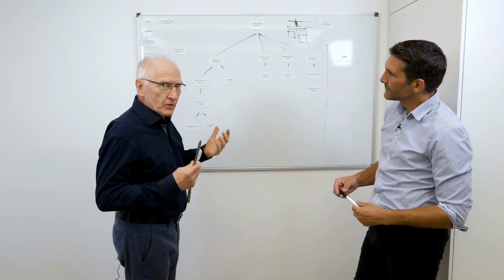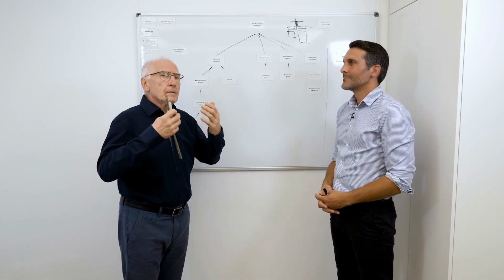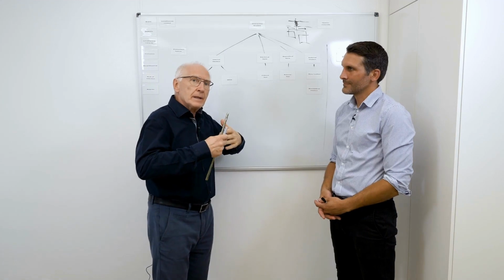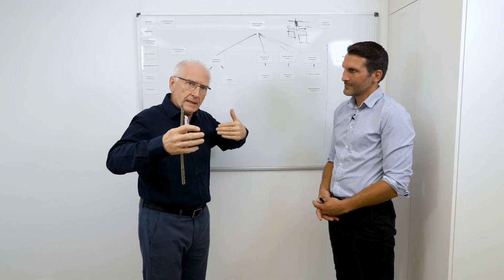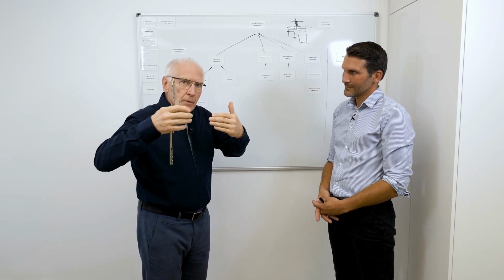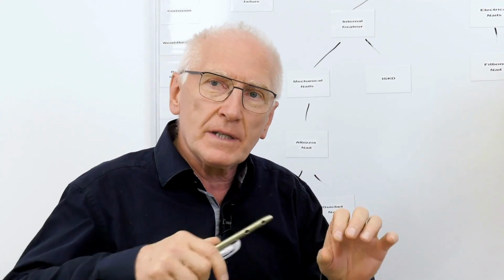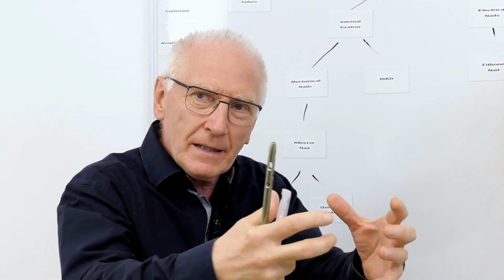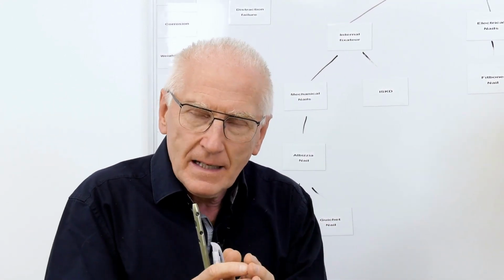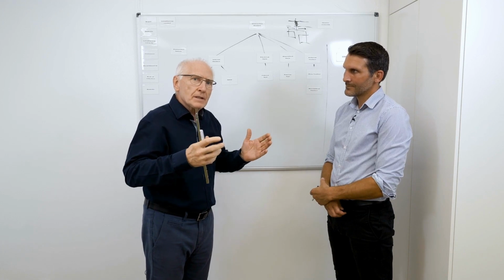Here, we must talk about the force we need to accomplish the extension at all. And the force can be provided from within by bringing electrical components deep inside, which ultimately facilitate the separation of the bone parts. Then we are extremely reliant on miniaturization. We do not have arbitrarily large medullary cavities at depth in which we can fit everything to accommodate dimensions. Unfortunately, that's not possible. We rely on very narrow medullary cavities. So the room for maneuver is very limited.